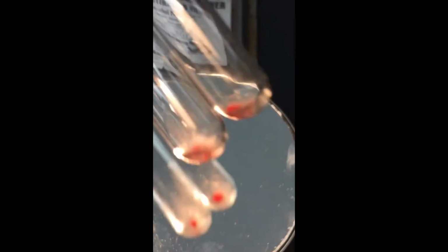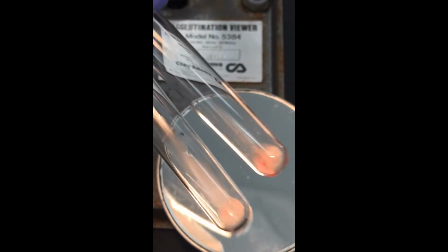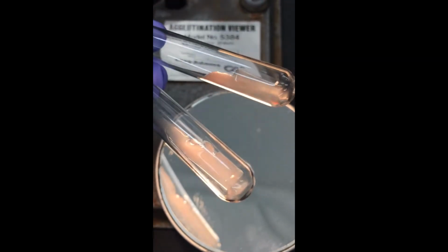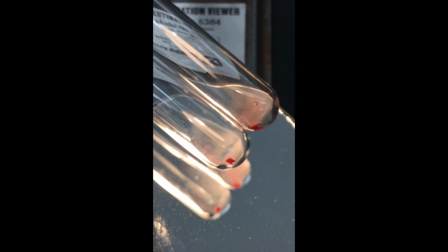Okay, we're in sample C, tubes 11 and 12, AHG. Tube 13 and 14.